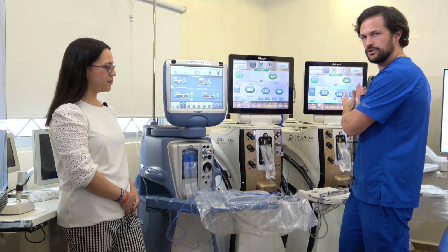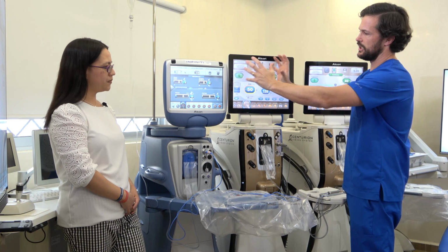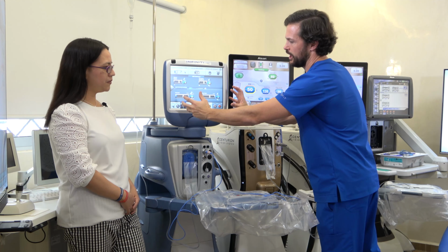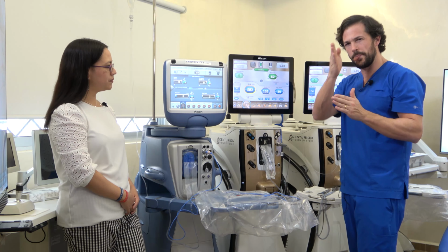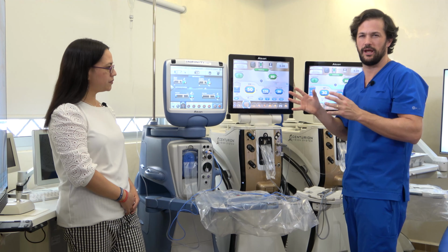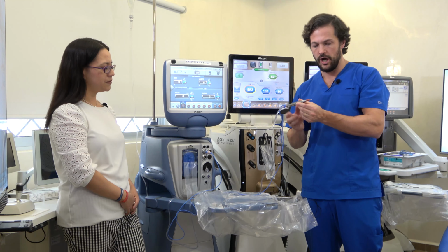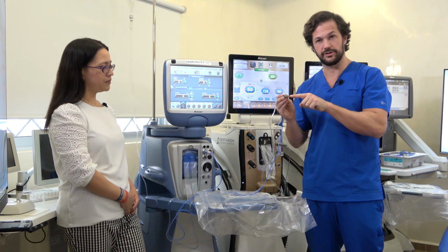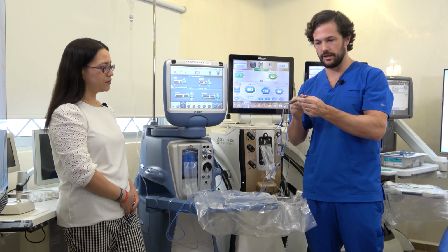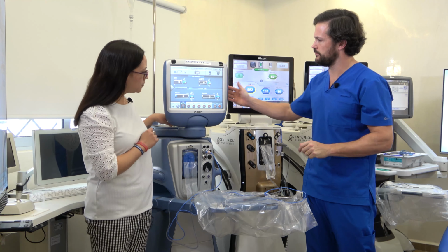So to talk about the machines, we're going to talk about two things: the ultrasound and the Phacodynamics, and the fluidics. We're going to divide those in two and see the evolution in each of them. The first thing is we're going to show you in a video how torsional ultrasound does the movement. So I don't know if you have any more concepts about that.